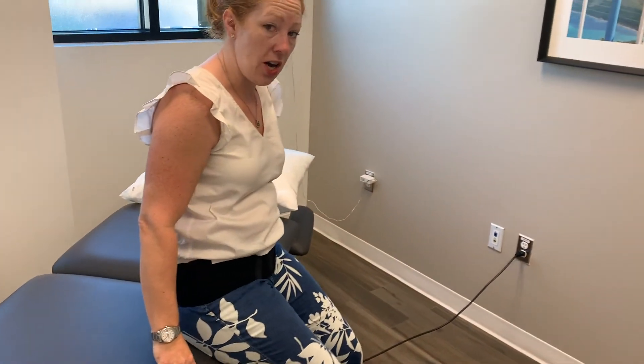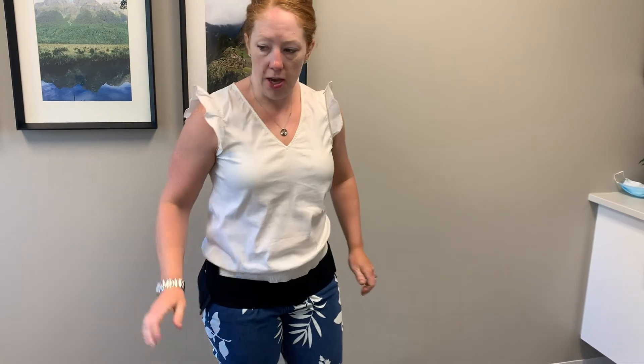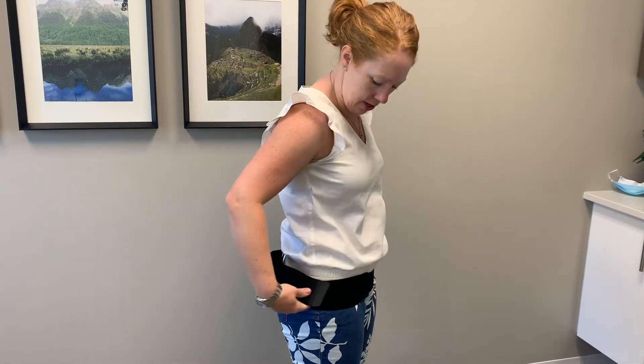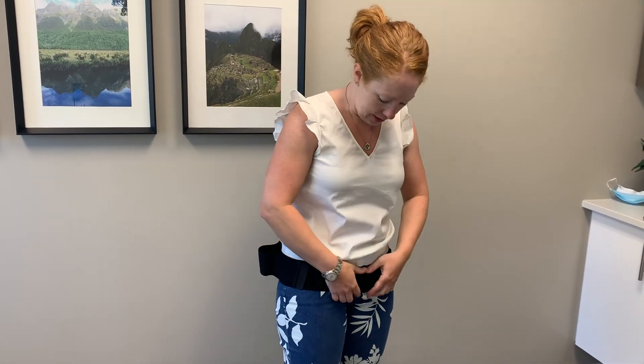If an exercise program isn't enough and you're having a lot of difficulty, that's where we'll sometimes suggest an SI belt such as this one. Sometimes the stability needed is in the back, and that's what you need help with. In that case, we would reinstall the straps to be on the front and pull them tight toward the back to cue your back muscles. So that's a standard SI belt.